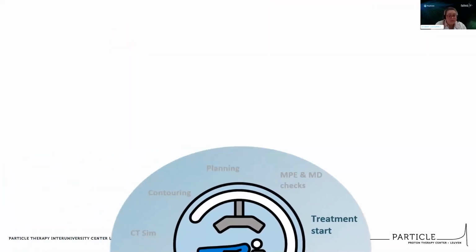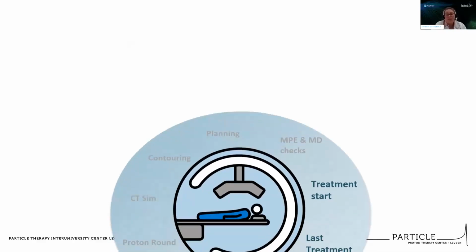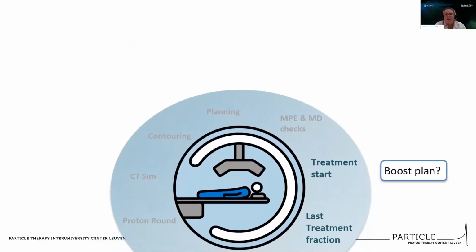And I would say that first session goes really well for our patient, and so subsequent fractions go really well as well. But one thing we can't forget is we still have our boost plan that we needed to finish off. Of course, we were lacking the final contours at the stage of treatment start, so in order to not lose oversight of this boost planning still needing to happen, a parallel replanning workflow was already added prior to treatment start of that first beam set.